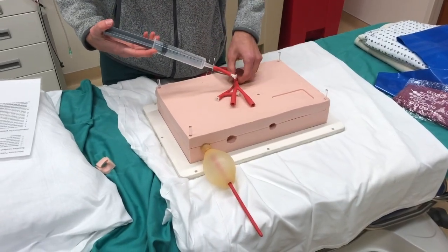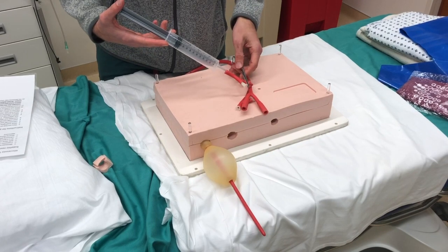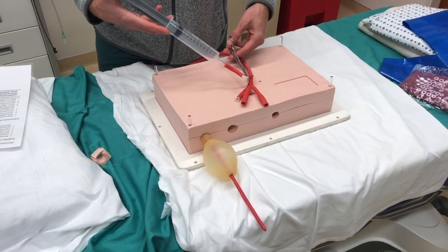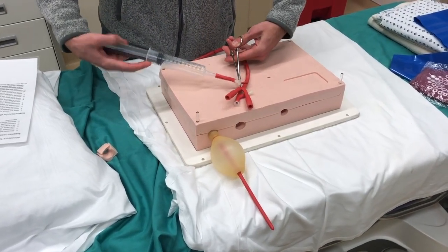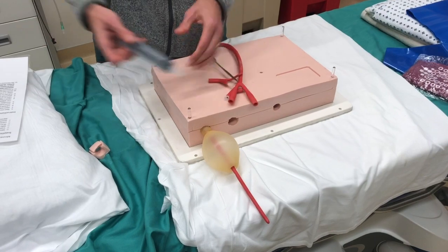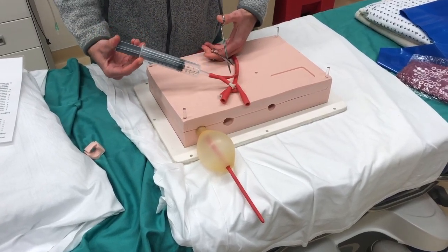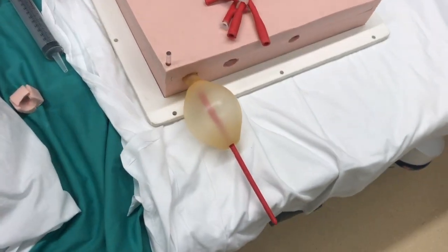After confirming the gastric balloon is inflated in the stomach, proceed to fill it to capacity. Inject another 300 cc's of air, bringing the total volume to approximately 400 cc's. Remember to Kelly clamp the port between every injection of air — release when you inject, clamp, remove the syringe, fill the syringe with air, replace into the port, release the Kelly clamp, and inject. This is roughly what 400 cc's of air in the gastric balloon looks like.